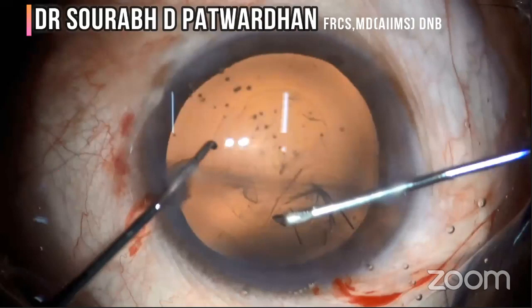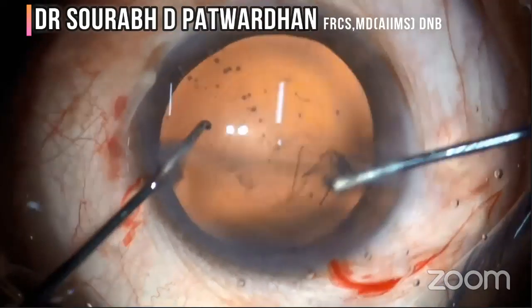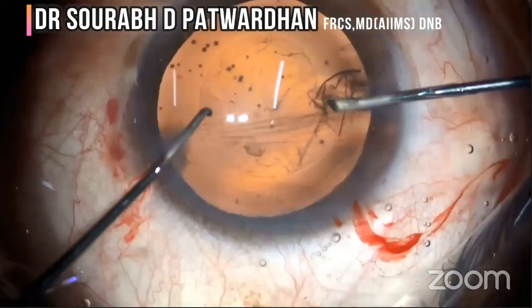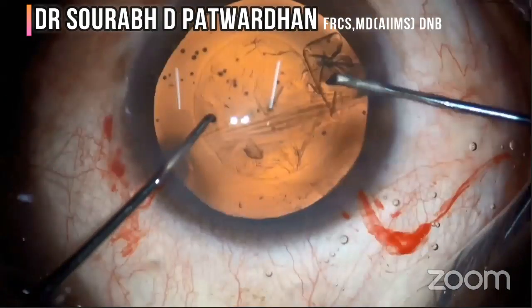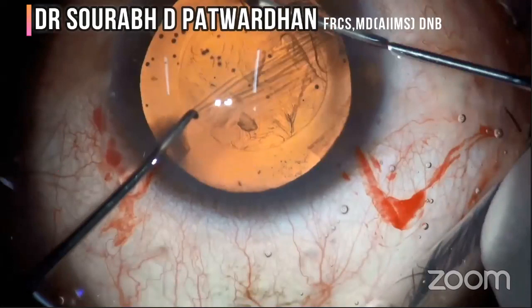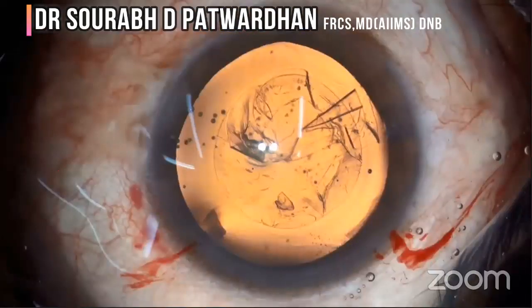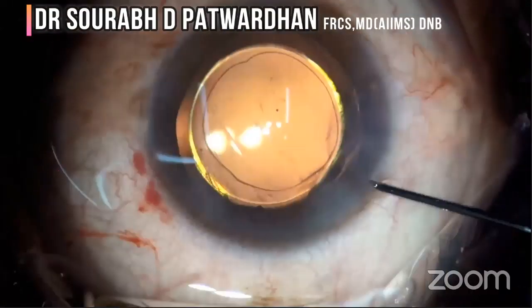Always remember, when you mark the cornea, there is a 12 to 15% magnification factor of the cornea. So when you follow those marks, you actually get a smaller size rhexis. For 6 millimeter, it is around a 5.2 to 5.3 rhexis size which you get.